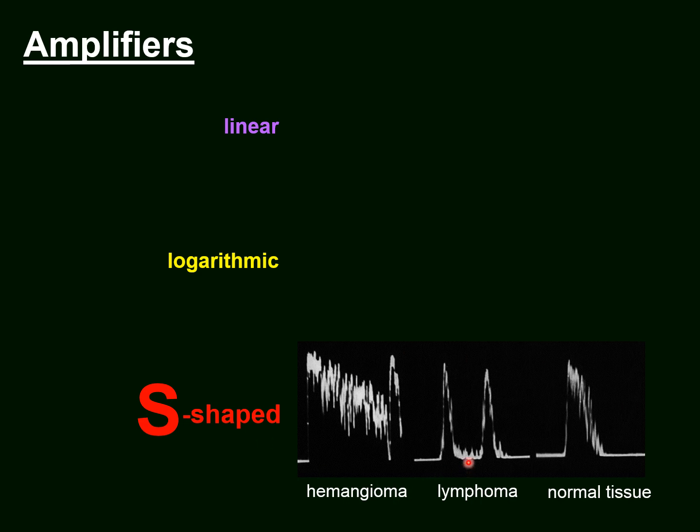You can see that the weakest signals are still visible at this sensitivity setting, and the highest signals are still not overloaded, still can be evaluated in regards to the height. You also see a difference in angle kappa: almost no angle kappa here, a clear-cut angle kappa of medium size, and a large angle kappa here. So quite a difference between those echograms that assures our ability to differentiate them.